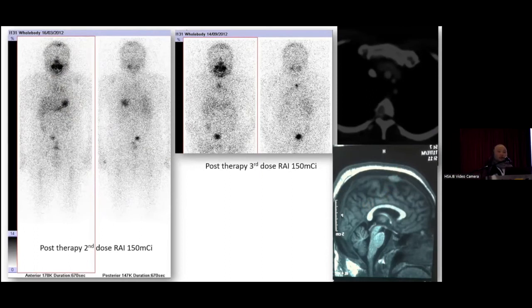So it totally changed the management of the patient. Instead of just treating as bone metastasis, we are able to send the patient to see a neurosurgeon, and they removed the meninges uptake, and they actually did a surgery for him, and also radiotherapy. Unfortunately, this patient did not make it. He developed a very progressive disease involving the lungs.